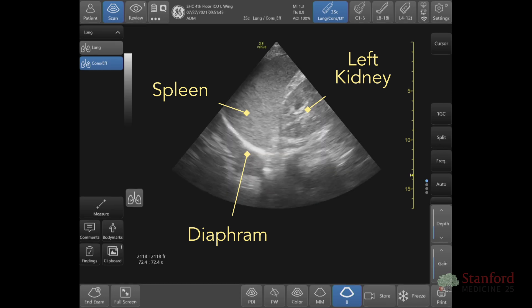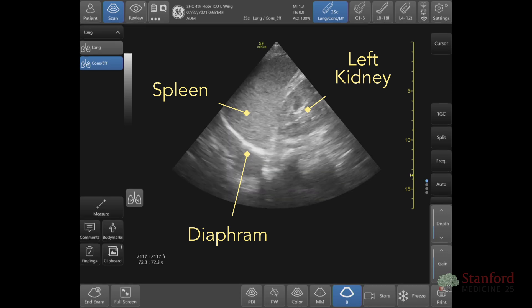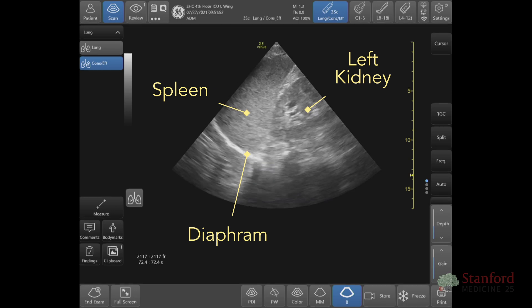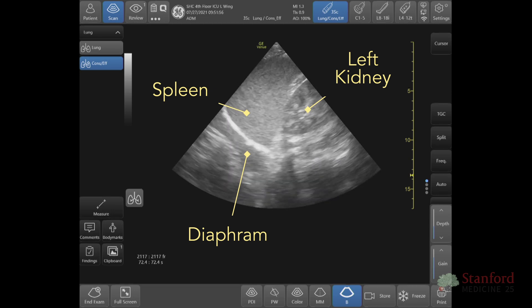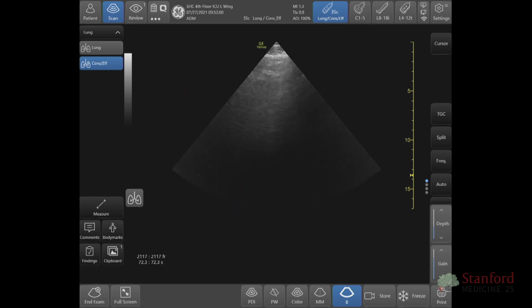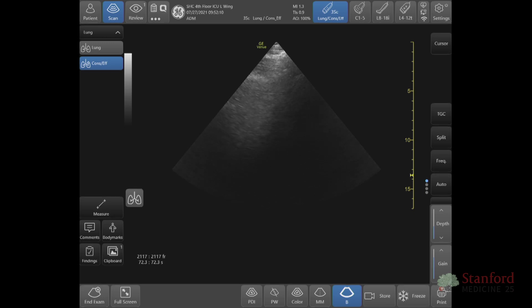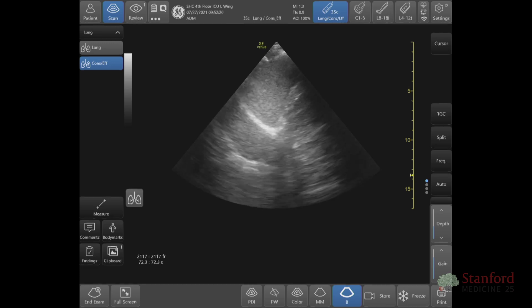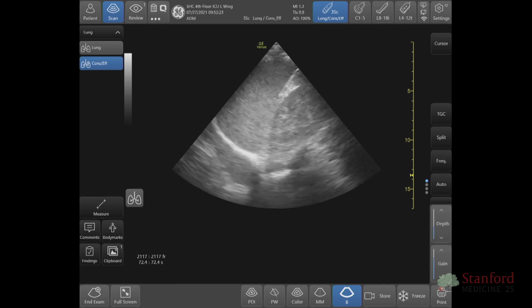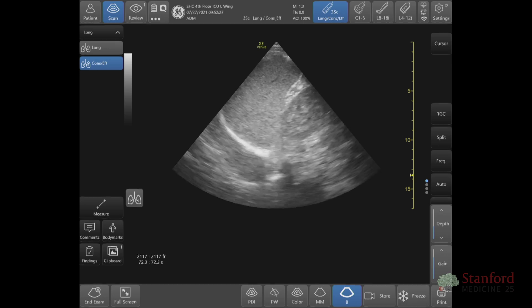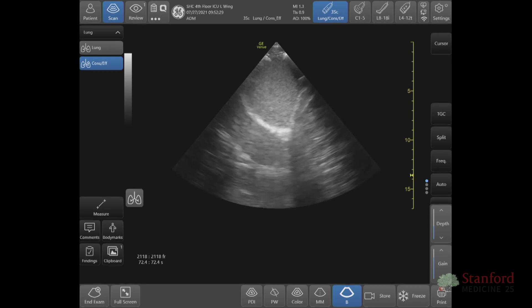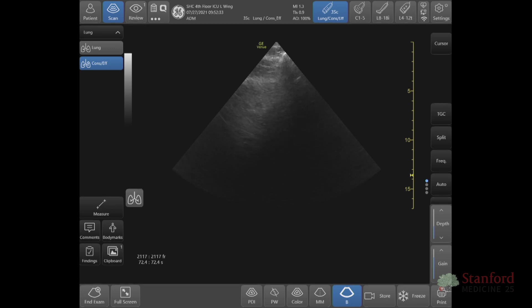Sometimes you won't be this lucky — the left side can be more difficult. When that happens, have the patient take a big, deep breath. Notice with that big deep breath, suddenly the whole screen went gray. What's occurring is that the diaphragm moved, and now there's air in between our probe and the spleen — that made our screen go fuzzy. We've essentially ruled out a large pleural effusion. We call that the curtain sign. Could the patient still have a small pleural effusion? Yes. But you can use the curtain sign to at least make sure it's not a large pleural effusion causing shortness of breath.